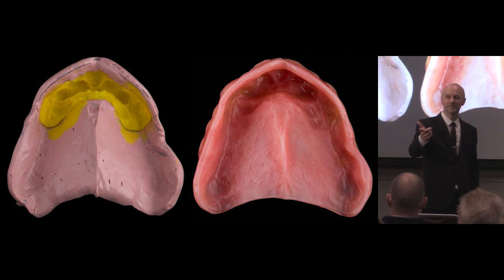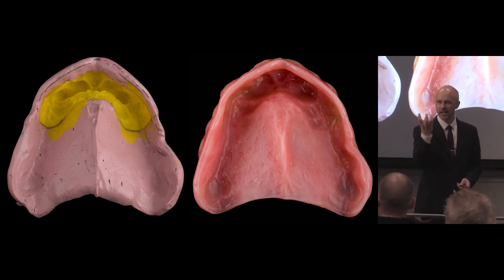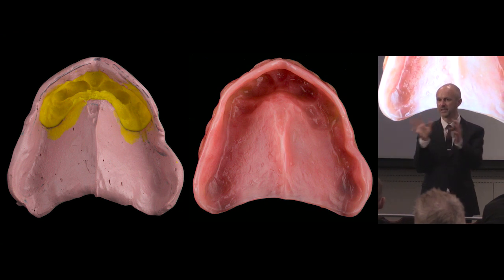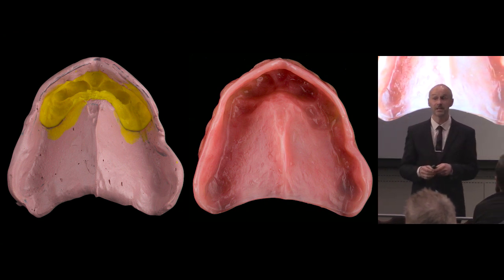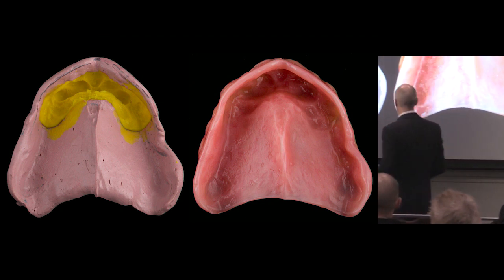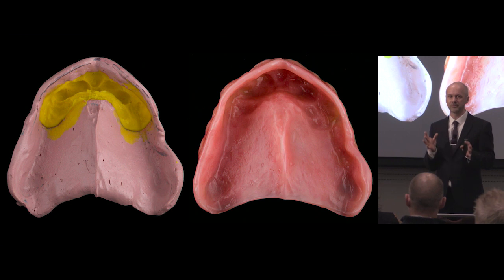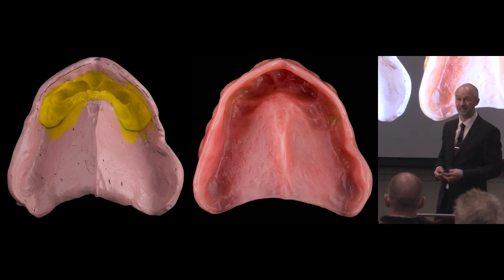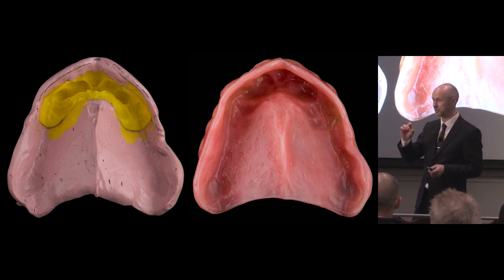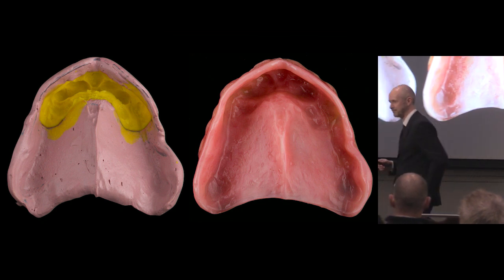Because I was talking with Simon about this just before. If you like a certain material and you get good results with it, just stick with it, but use these principles, really. It just needs space to go into. Most special trays are overextended, they're horrible, and they just need to be cut back 2 millimetres short of the sulcus depth.